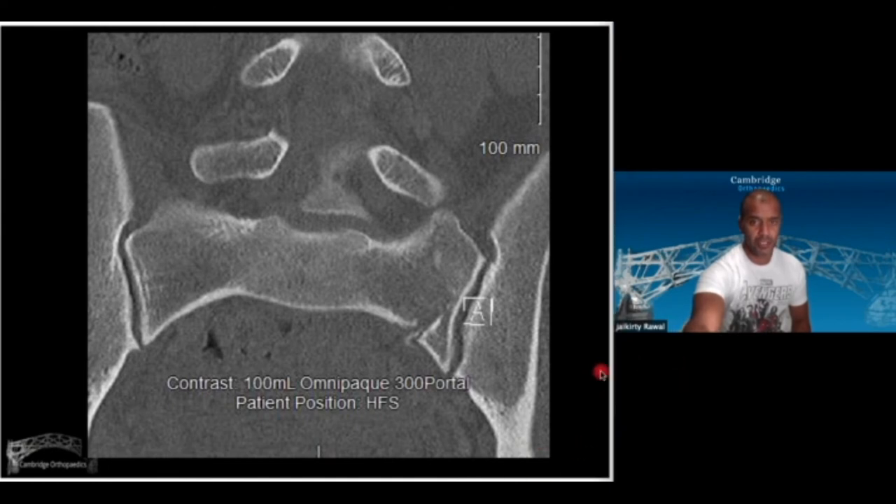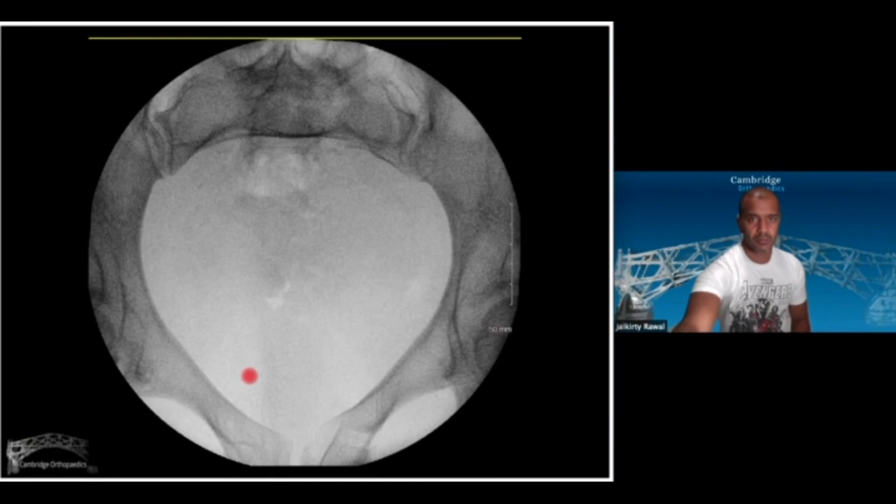This here looks pretty standard — a sacral alar fracture. This is the fall from the horse, by the way. Comminution at the front, SI joints look pretty symmetrical. This patient was in a lot of pain — high energy mechanism of injury, a lot of pain, couldn't cough, couldn't roll in bed. The CT was done outside of a binder, so there wasn't any real deformity to see. Despite a trial of mobilization with the physios, this all failed, and the question was: is there more than meets the eye? Am I missing a really unstable pelvis?